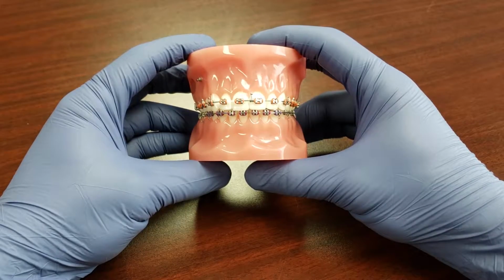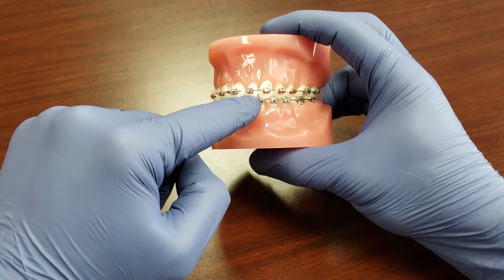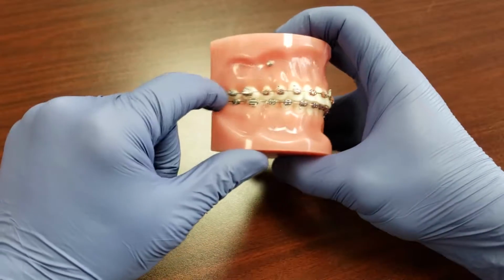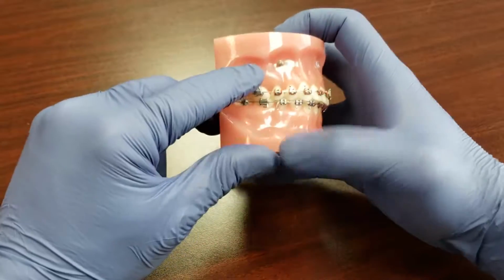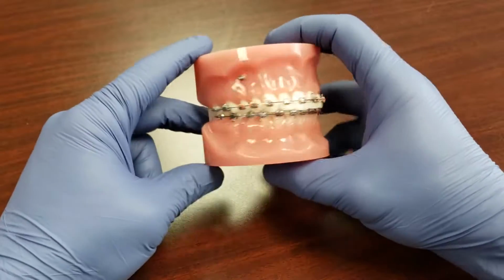With this video, we are going to talk about those pesky pokey spots with braces. So what do I mean? It could be a little hook like this. It could be a hook like this. It could be a tad sticking up in the gums like that, or it could be a wire sticking out the back. There's all kinds of different things that poke you with braces.